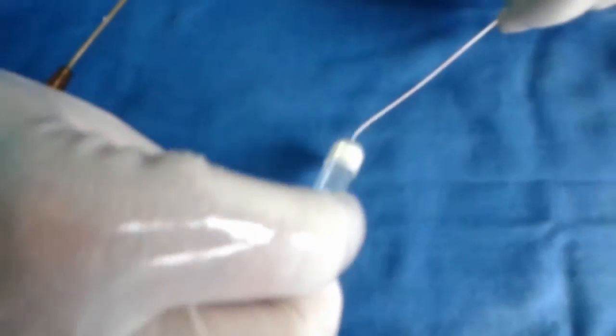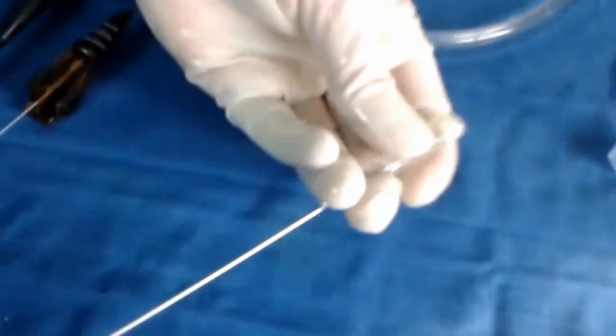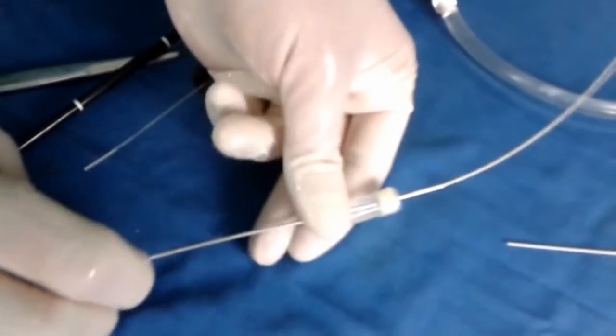However, the spontaneous insertion of a guide wire or a basket is almost impossible. It necessitates the use of a puncture needle or an introducer.